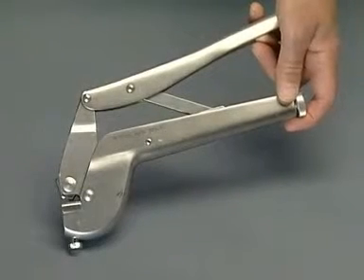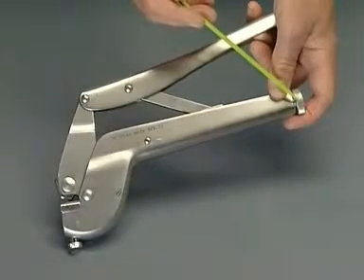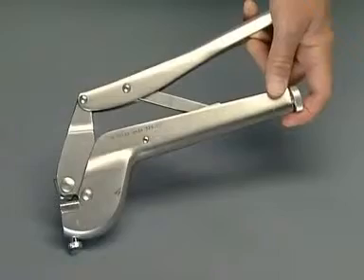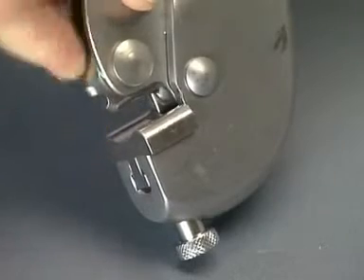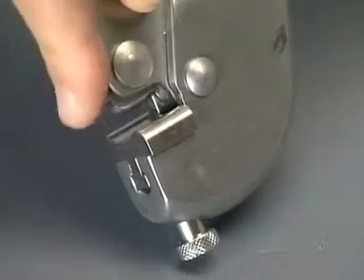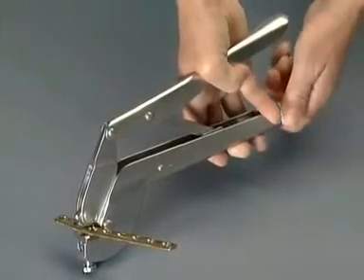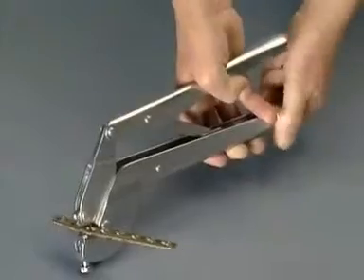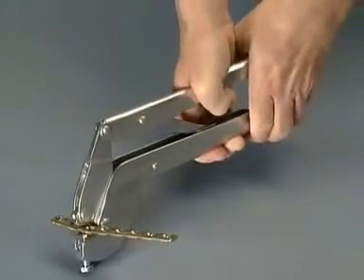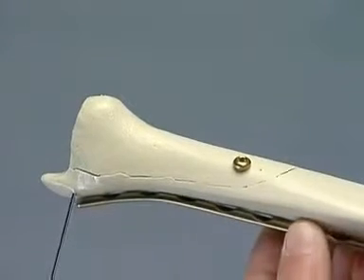The plate may also be contoured with the bending pliers. Again, the pressure is adjusted by turning the screw on the handle. Note that there are different curvatures. The appropriate position is selected. If the plate is held at an angle, it can be bent and twisted at the same time. The plate is now ready for application and is placed on the bone.